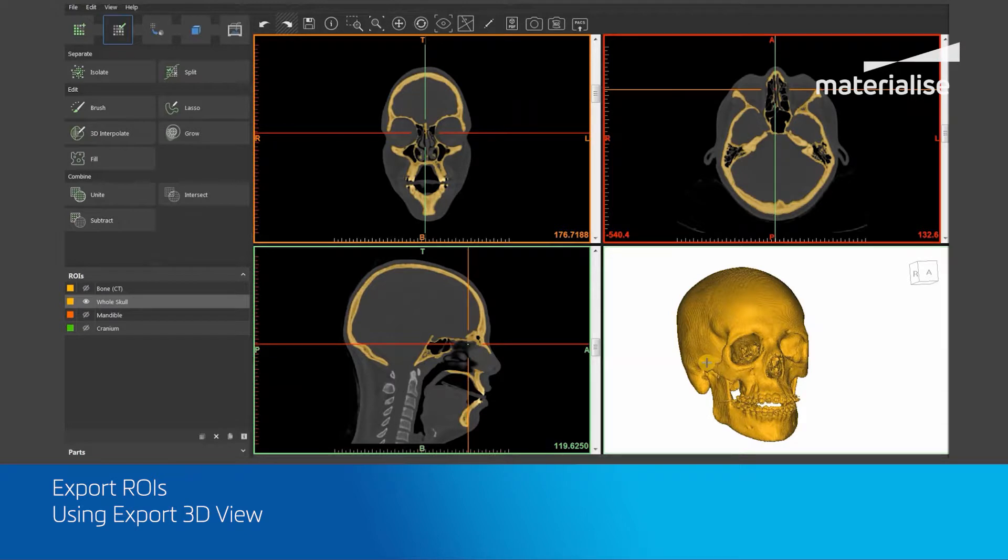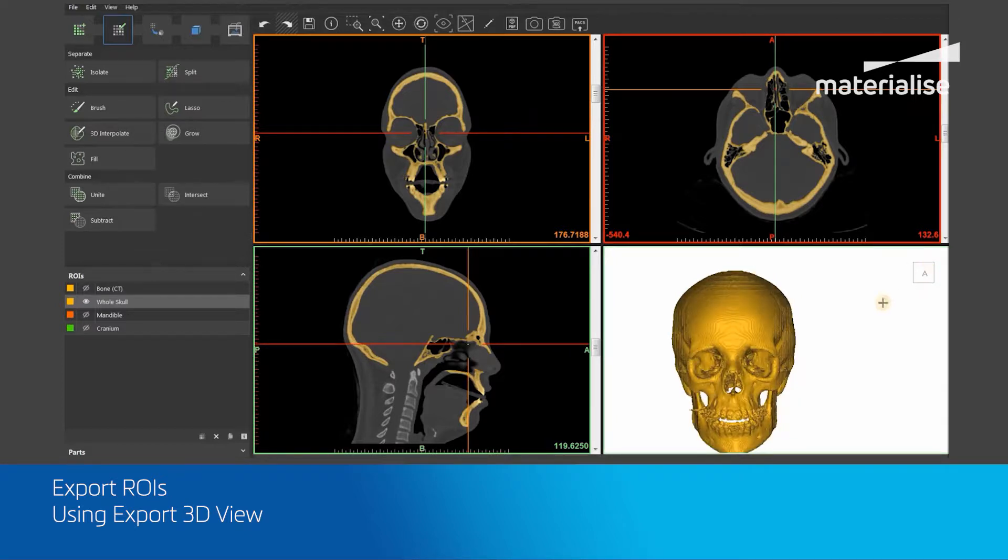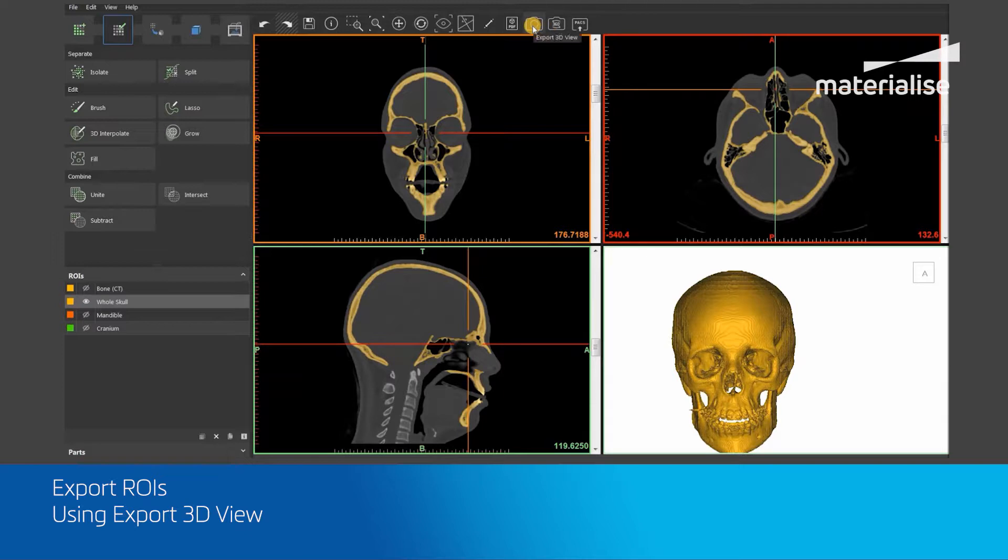Now I will reorient the whole skull ROI to the anterior view by clicking on the A position within the orientation cube. Next, I will click on the Export 3D View tool, represented by this camera icon within the general toolbar, to take a snapshot of the current ROI view in the 3D viewport.